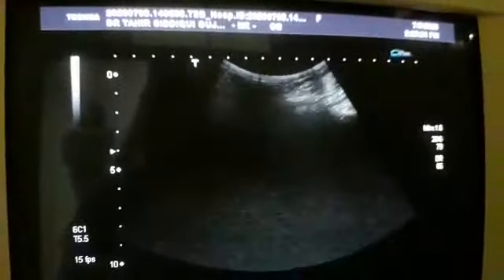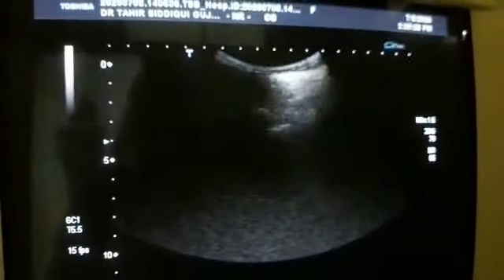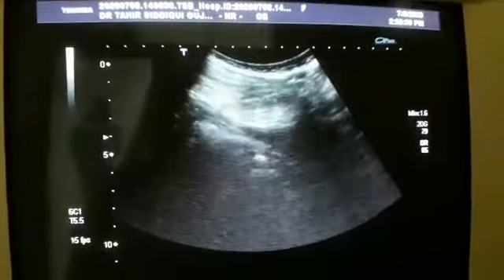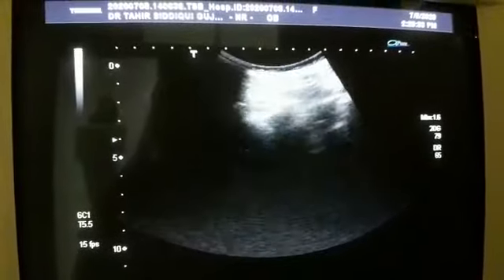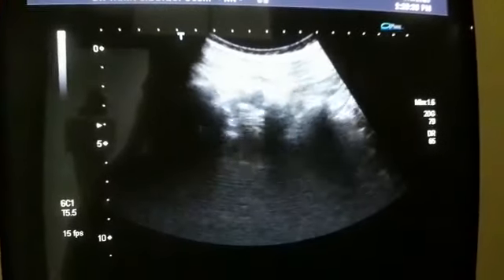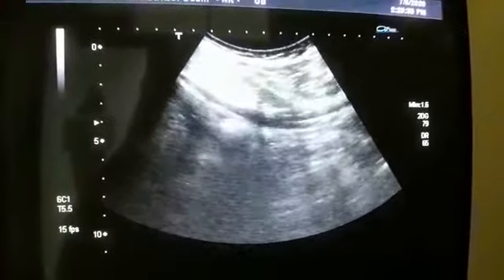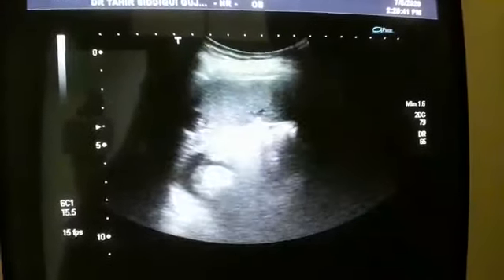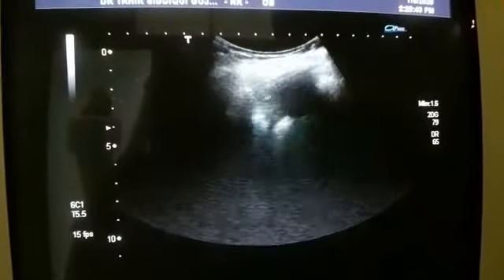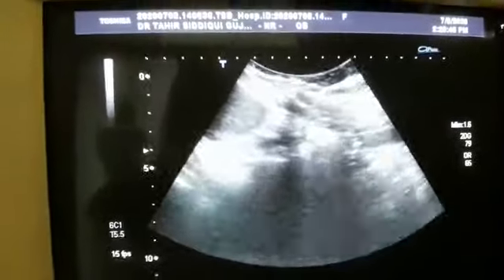Left kidney, even from the back prone position, there is no evidence of kidney. You see the vertebral, but here as I move up, no evidence of the left kidney.